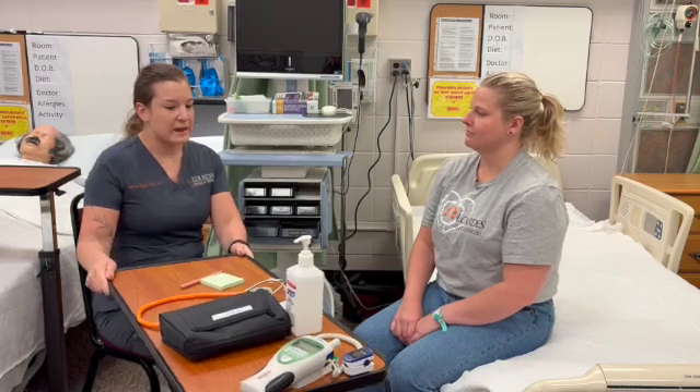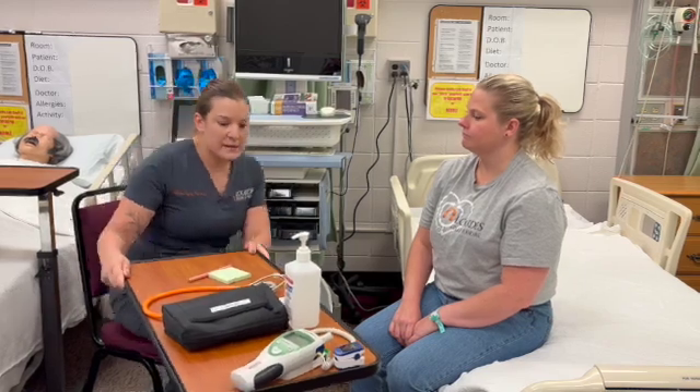And then on a scale of 0 to 10, what would you say your pain level is right now? Zero. Perfect. So then we can get started.